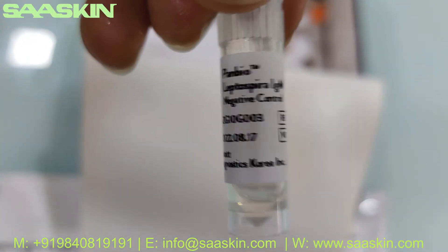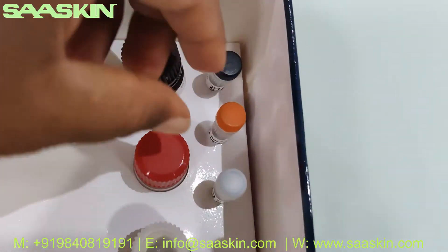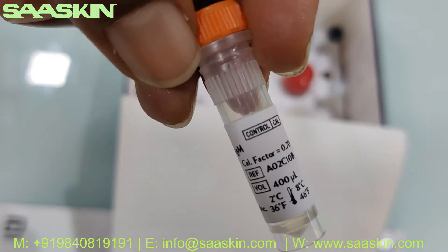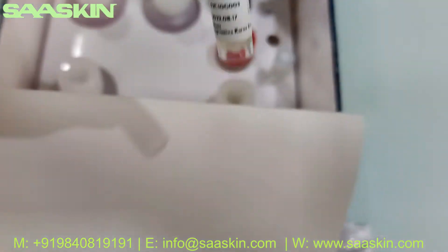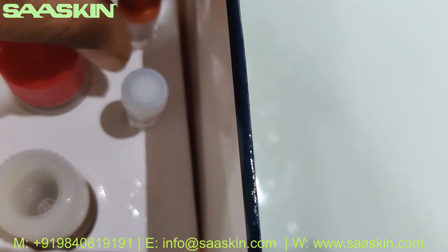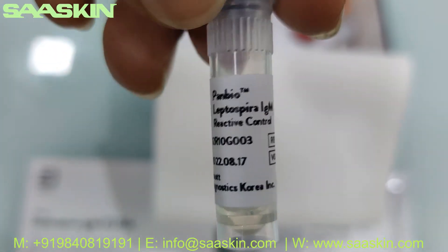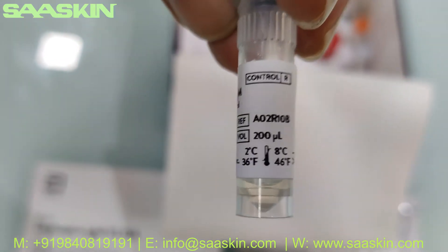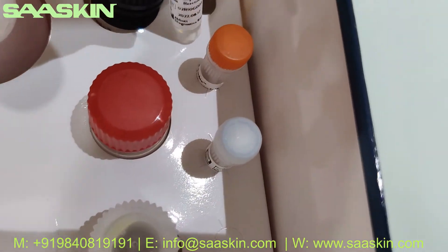This is the negative control buffer liquid used to check results. You also have the calibrator — here is the calibrator bottle, which is 400 µL. And this is the positive reactive control, which is 200 µL.